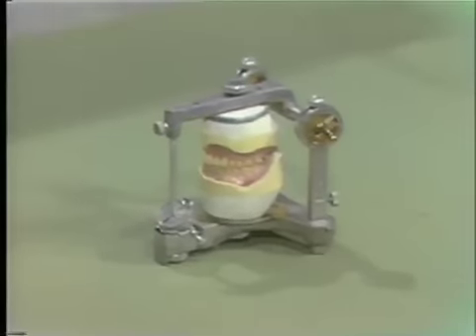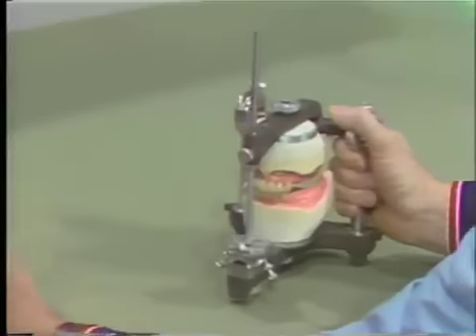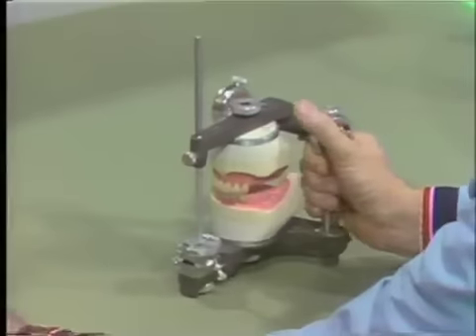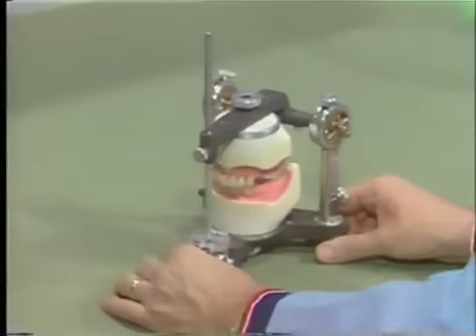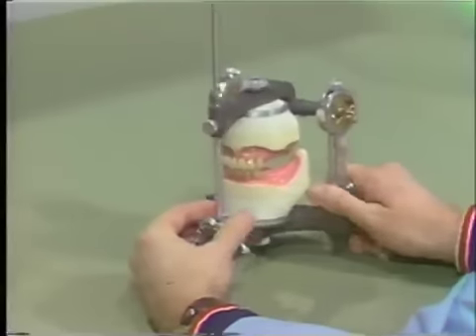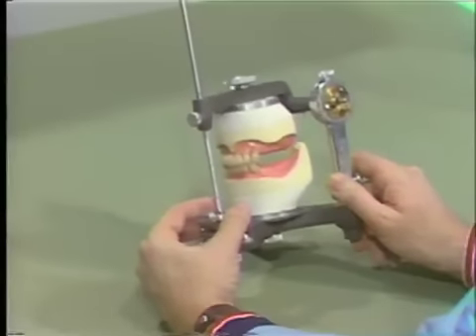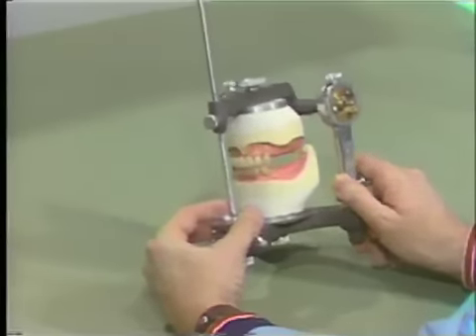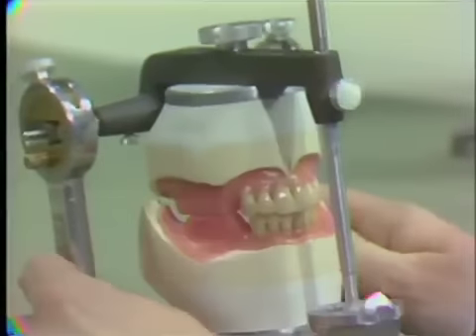In making the second denture setup, we are going to attempt to balance the occlusion. From the information we've had in the lecture and from the information on the handout, we're going to show a short demonstration on how to begin to set the teeth so they balance. With all three of these references, you will be able to balance the occlusion with these teeth fairly successfully.